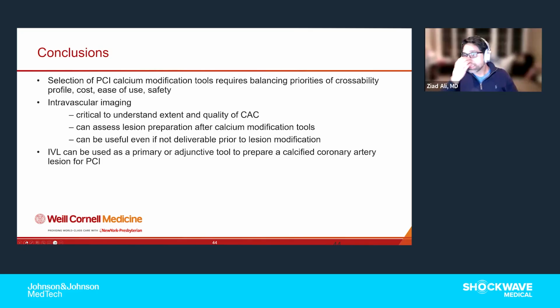I guess one other approach that we didn't discuss, but has its own risk to it, you created quite a gutter and you had a lot of wire bias. Would you consider going back with a larger burr because you only used a 125? That would be another possibility. But again, given I think the eccentricity of this thing and the tortuosity, I mean, that's the advantage of a balloon-based strategy, in my opinion.